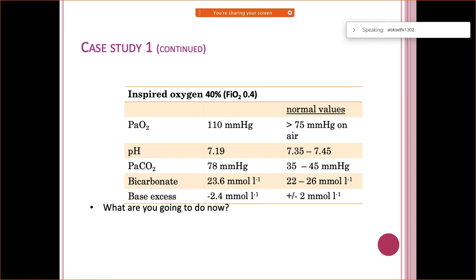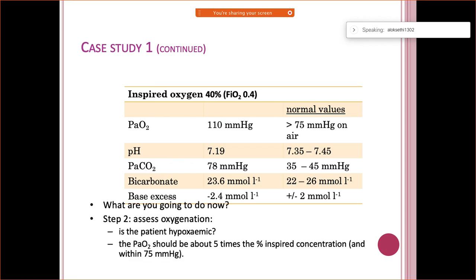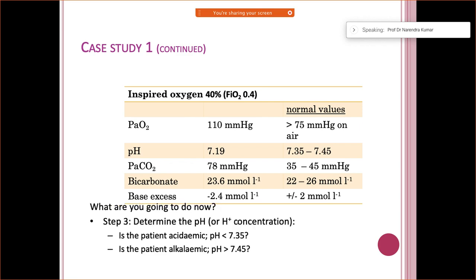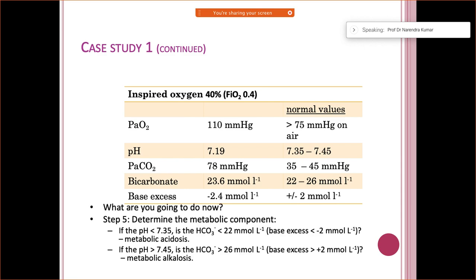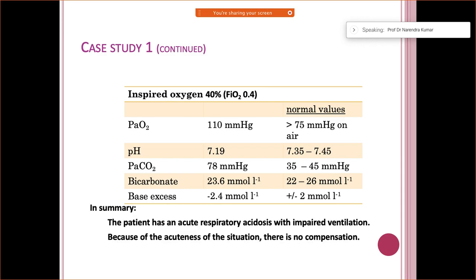Now the trick comes. So what is it? Respiratory acidosis. Good. So you are all already the masters now, so I need not teach anymore. You all know very well, in fact. And yes, the other thing was acute or chronic, right? You all did not calculate it. You are forgetting it.